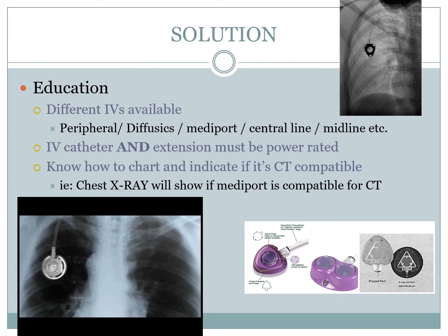And overall, the goal of this is to have all medical staff, as I mentioned, nurses, CT technologists, physicians that are involved with the process of obtaining a diagnostic CT contrast enhanced exam, is through awareness and practice of proper IV access for the desired study. I truly believe that once a collaborative understanding from all parties is in place, then a successful scan can be obtained for our patient. So let's get to it.